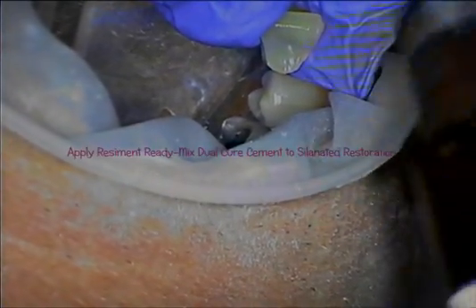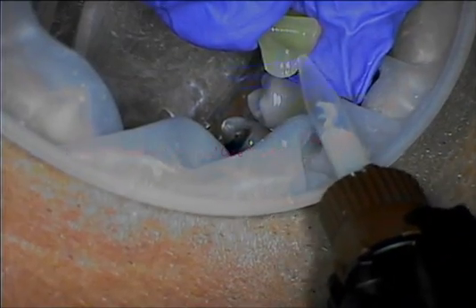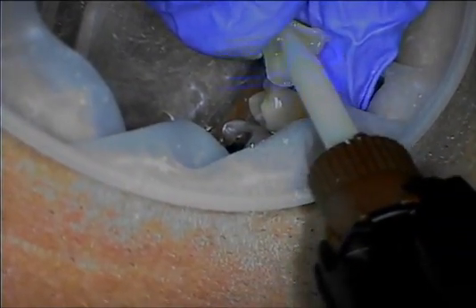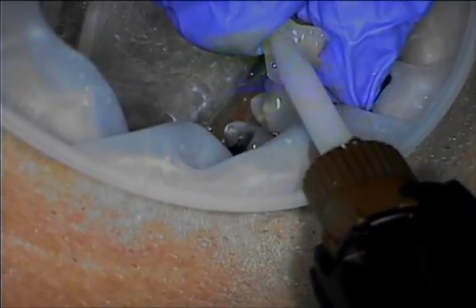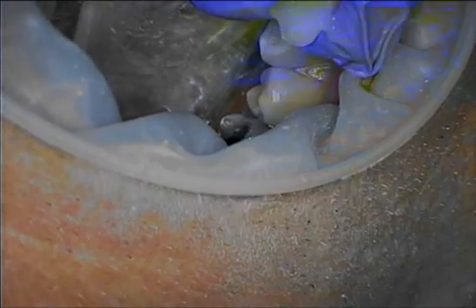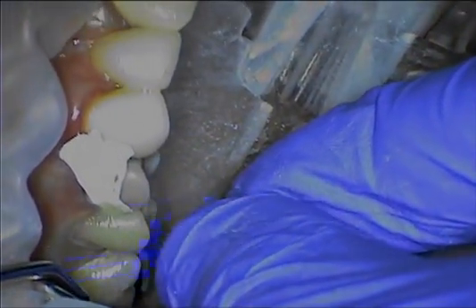This prevents pooling. The Resoment ReadyMix Dual Cure Cement is loaded directly to the intaglio of the restoration. In some situations, such as inlays and onlays, the cement can be applied directly to the preparation. The restoration is gently seated to make sure it's fully seated in place and the margins are all the way down.